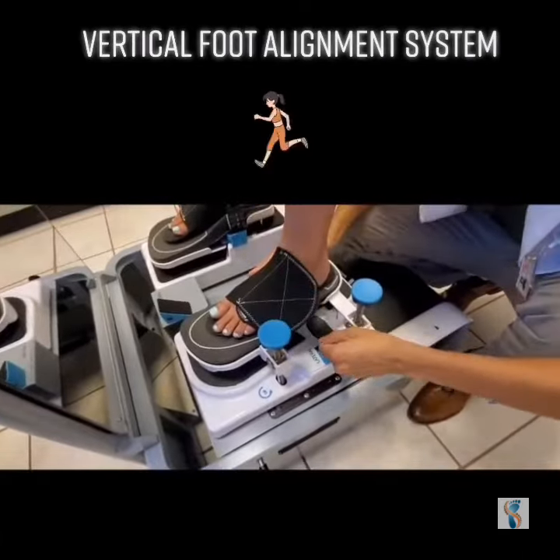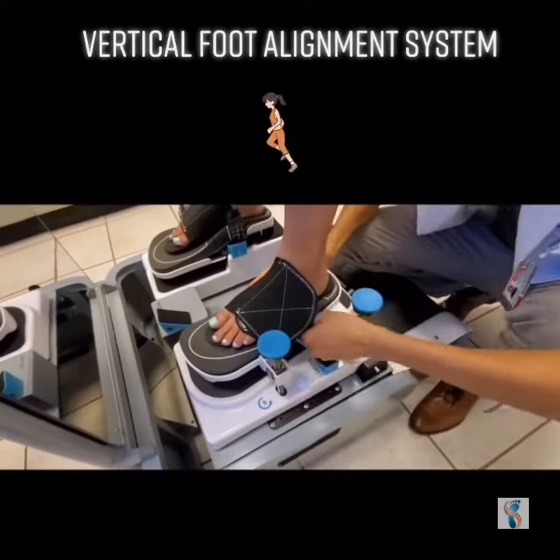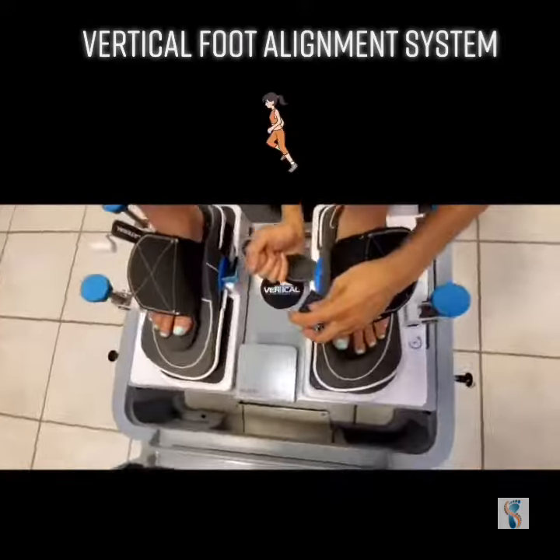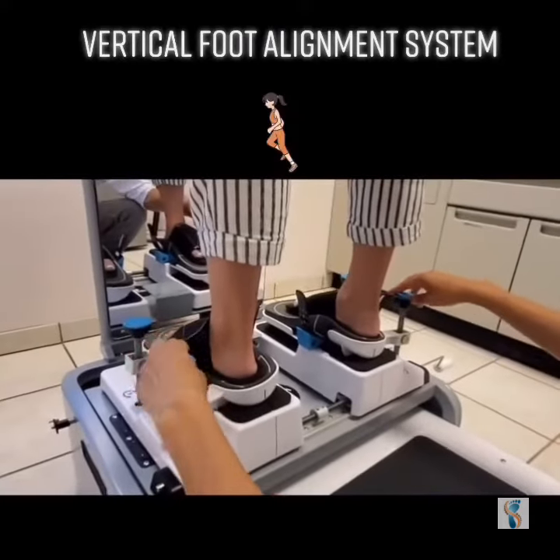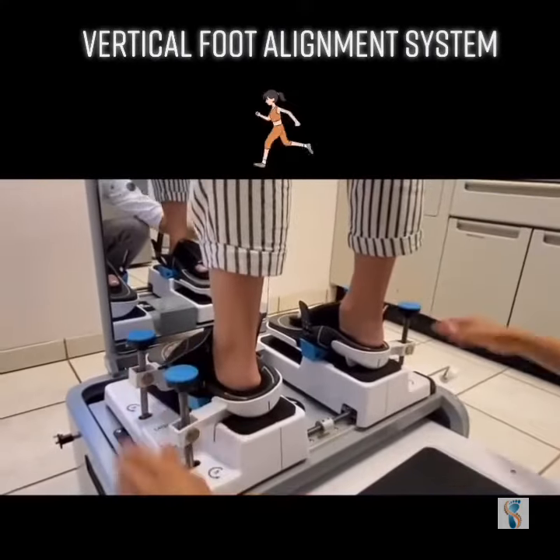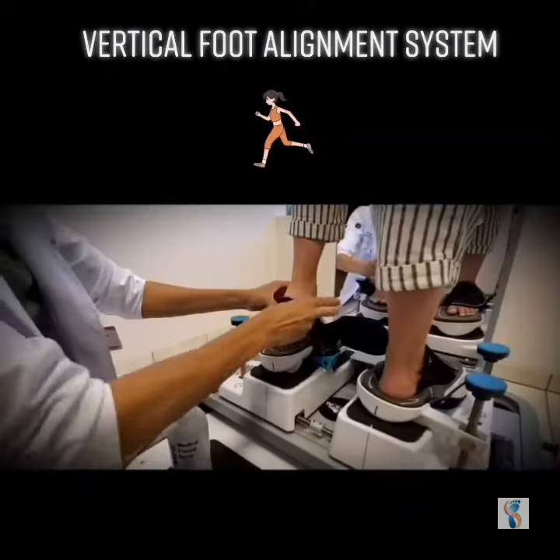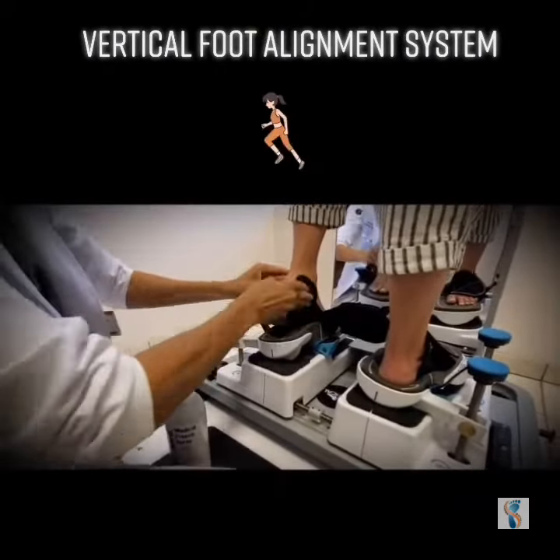This system also allows us to correct the amount of rear foot valgus and varus deformity in the rear foot, as you can see in the next image. We place the patient in their base of gait, which is critical for making a good functional orthotic. We do the final molding with the patient in the heel-off position and solidify the shape with the medical grade freeze spray.